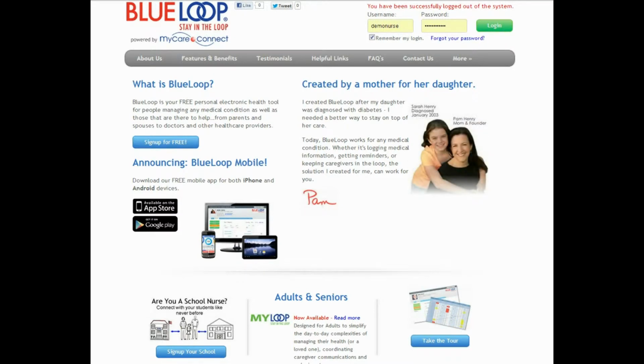So using Sarah as an example, she is my daughter. She's 16 years old now. She tests herself in the classroom, so she'll pull out her test kit, do that test, put her test kit away, pull out her iPhone, enter the information, click submit, and put her iPhone away. She's done within a minute and a half or so, and instantly the school nurse gets an email, I get a text message, and my husband gets a text message, but only if she's out of a certain range.